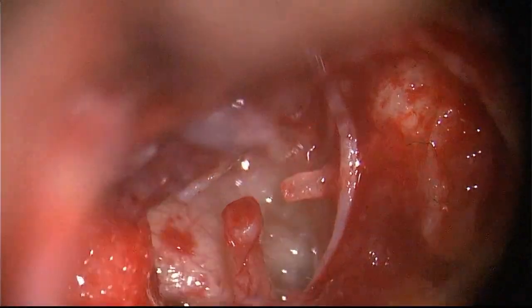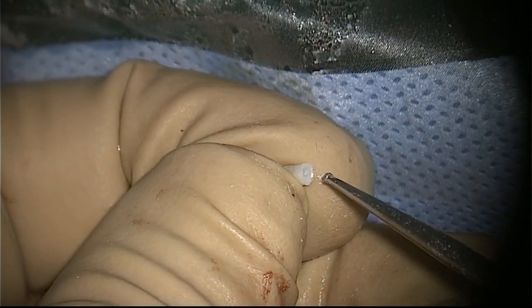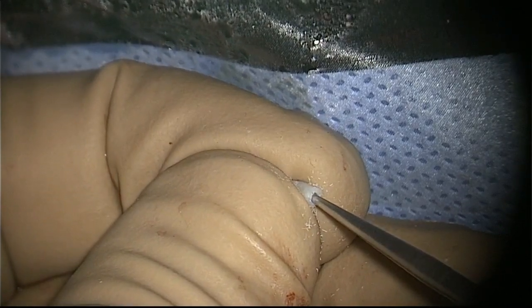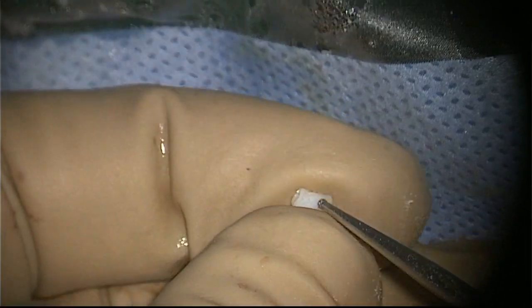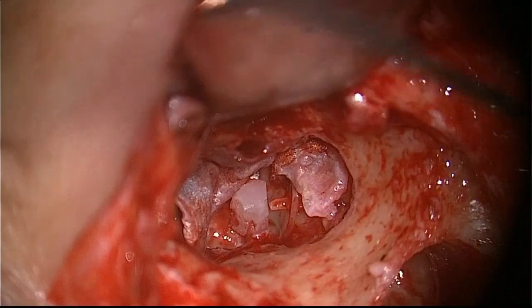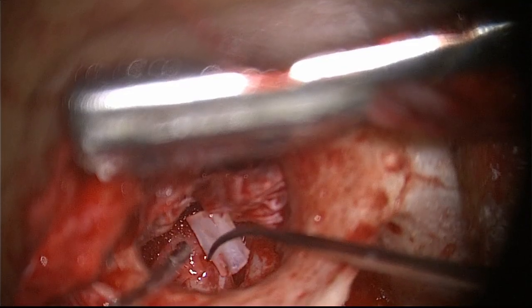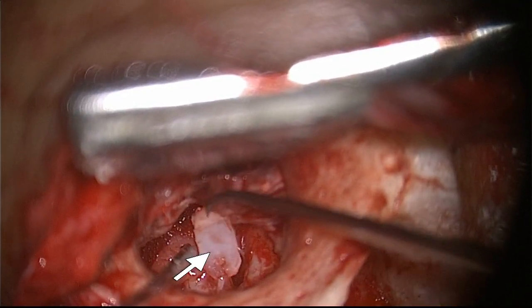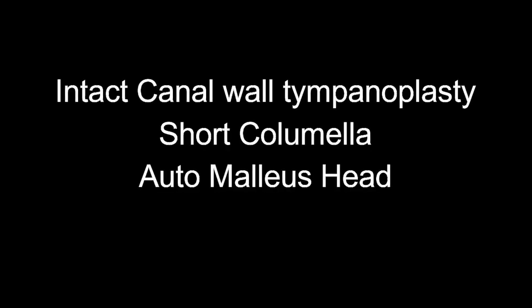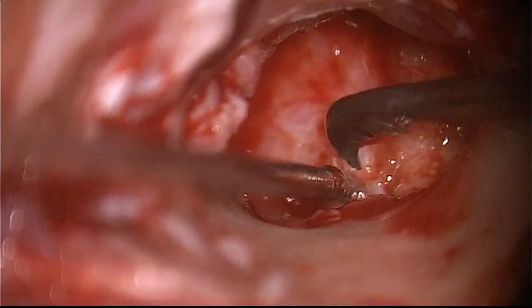So then I stopped using all the alloplastic materials and I started using the homograft ossicles or the autologous graft. You can see in this patient I am using a septal spur cartilage, homograft septal spur cartilage, as a short columella. I am making a facet to sit on the stapes as a short columella. I made a small cut in the cartilage as you can see, which exactly fits on the stapes and the stapedius tendon.